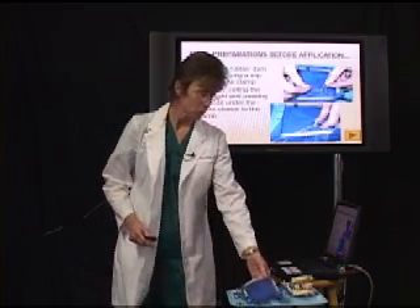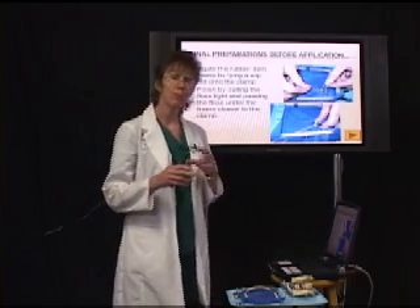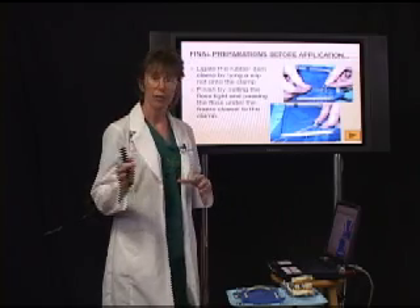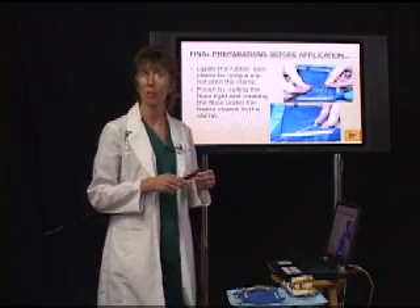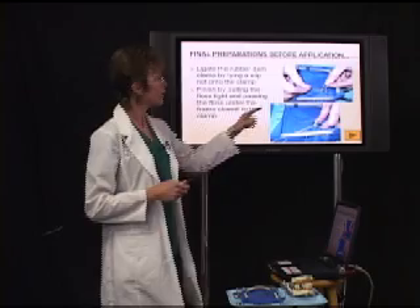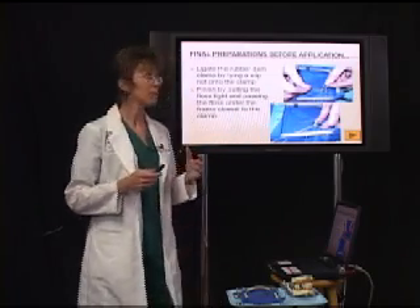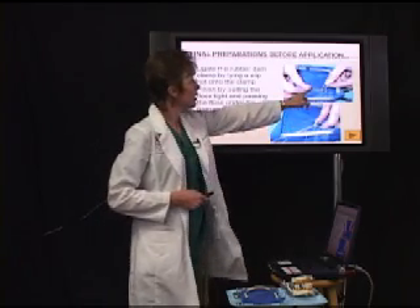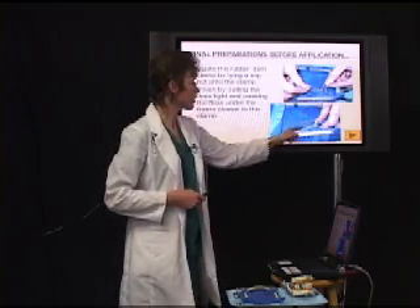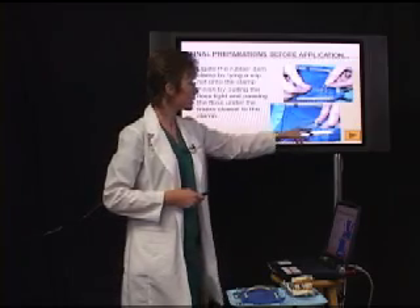The next step is to ligate that rubber dam clamp. The reason is, if it pops off during our procedure, we don't want it flying off or going down the patient's throat. So we take a piece of floss, double it up, put the looped end through that little ring section, then tie a slip knot — take the free end of the floss, put it through your loop, and pull it tight. Once tight, place that floss underneath the side of the frame nearest to the clamp.